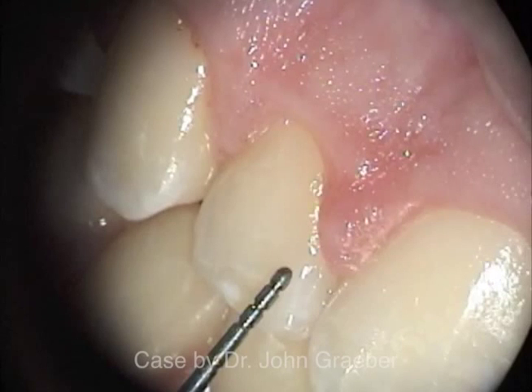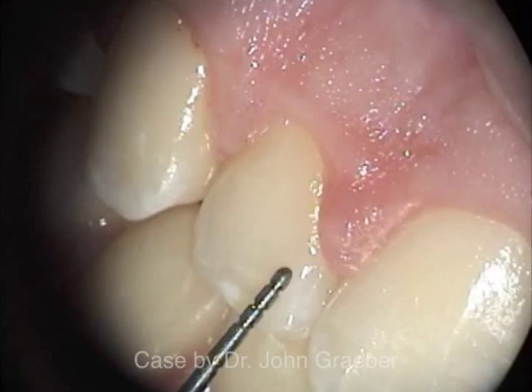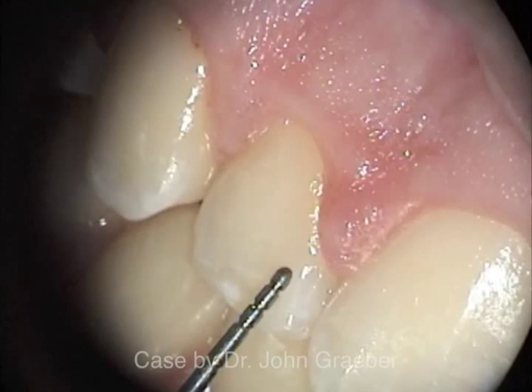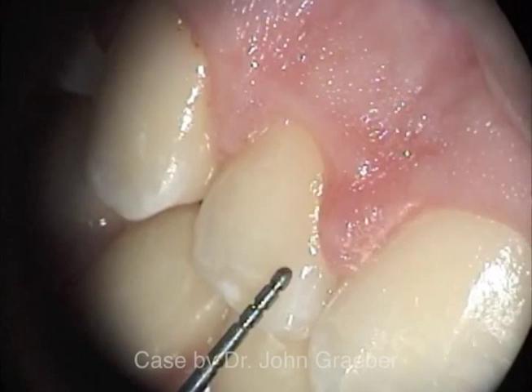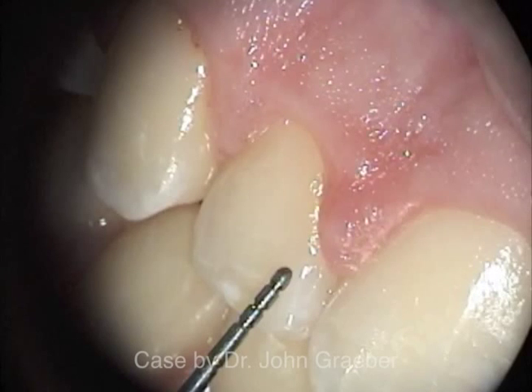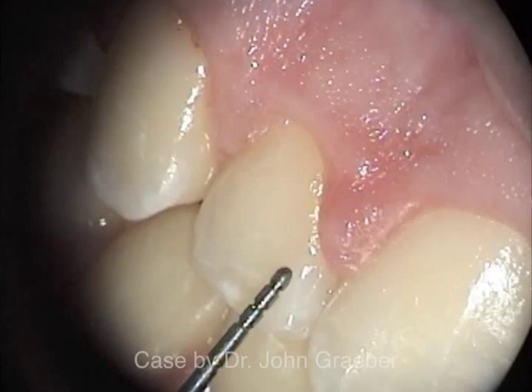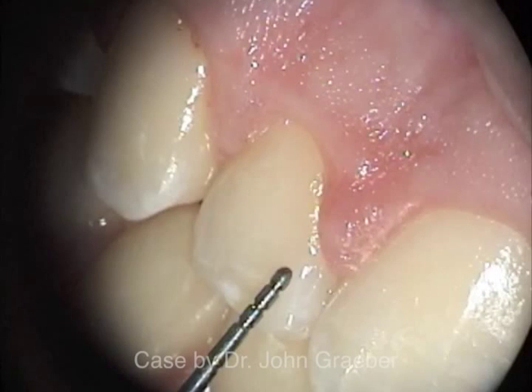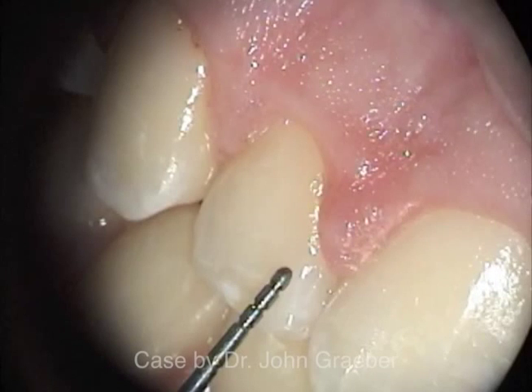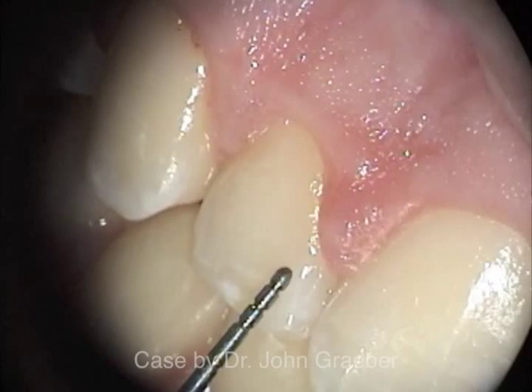By definition, all excess tissue above the epithelial attachment can be removed without violating the biologic width. In this presented video case, a post-orthodontic papillary hyperplasia is easily surgically managed with the Pioneer diode laser.